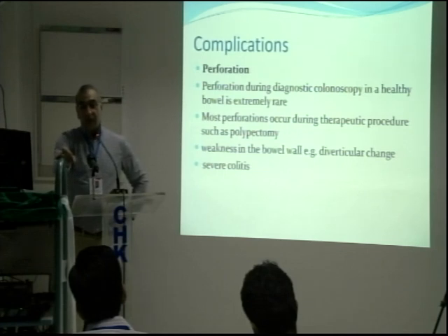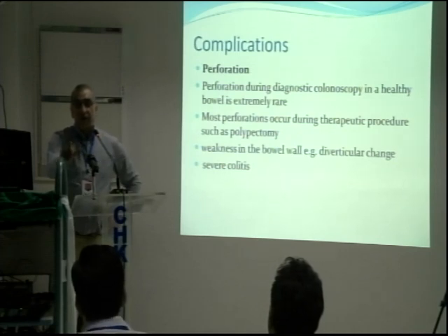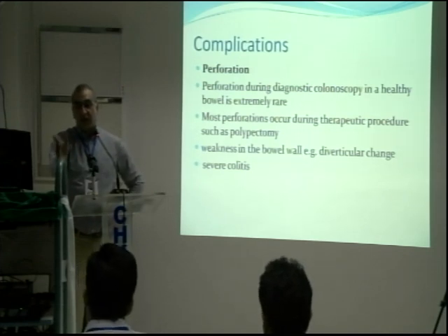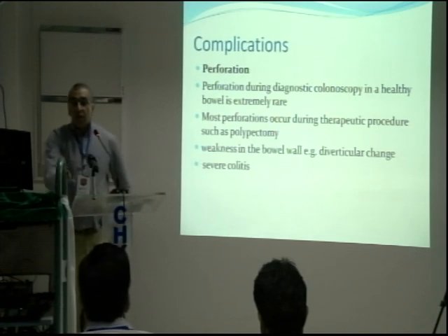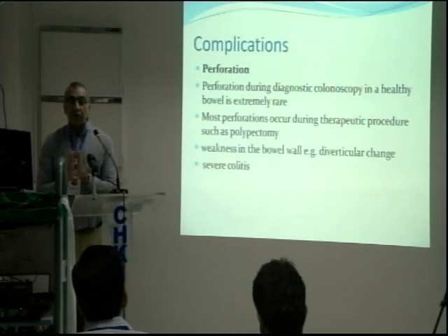I've been doing endoscopies since 1996. The only time I had a massive hemorrhage from a pinch biopsy was in a patient who had antiphospholipid syndrome. So she had quite a bad hemorrhage, but that is just a one-off thing, in over nearly 30 plus years of experience. So hardly any, right?